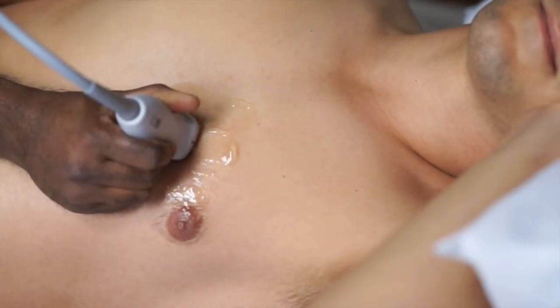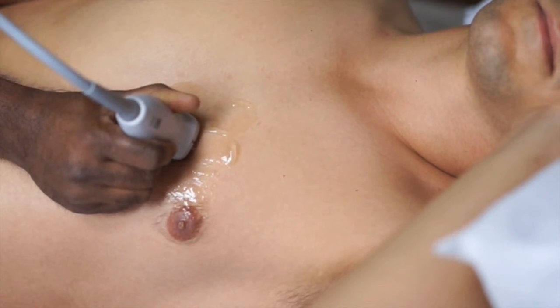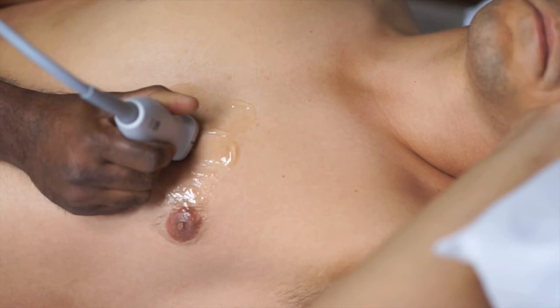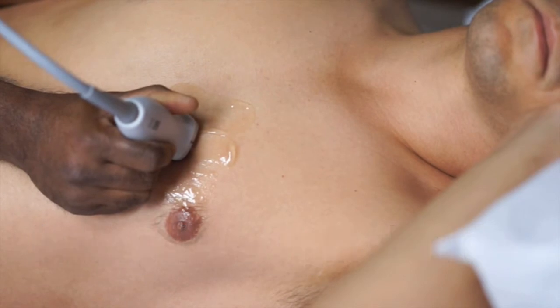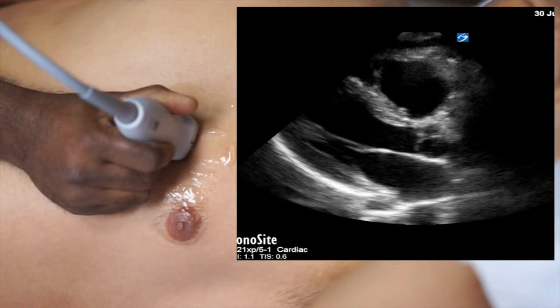The first view is the parasternal long axis view. To get this view, the probe is placed in the 3rd or the 4th intercostal space, just to the left of the sternum, with the index point pointing towards the patient's right shoulder. You may have to move your probe around to get the correct view.